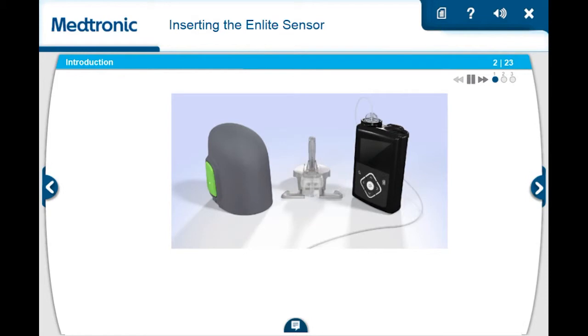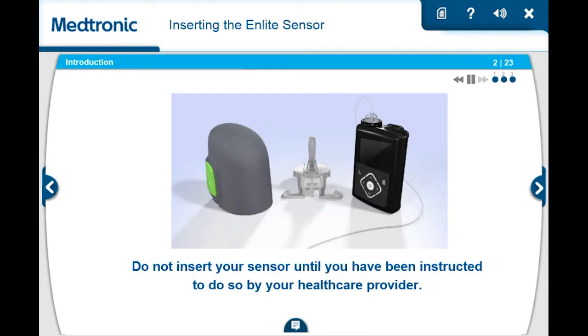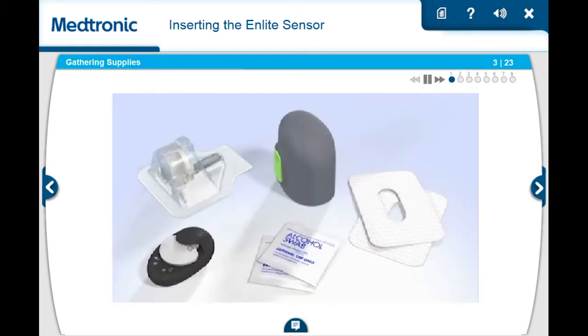In this course, we will show you how to insert an nLite sensor. We will also show you the steps to start a new sensor on your pump. Do not insert your sensor until you have been instructed to do so by your health care provider. When you are ready to insert your sensor, gather the following supplies.